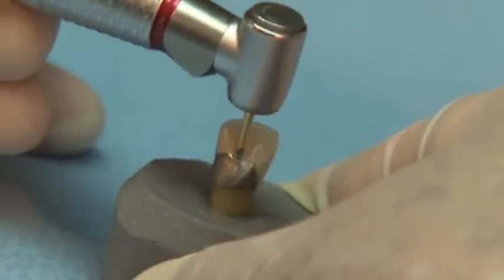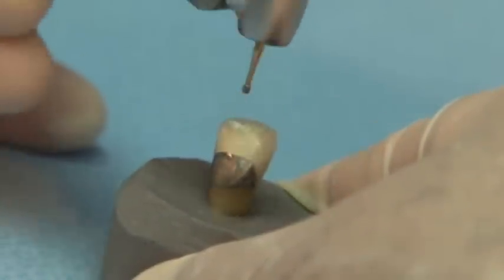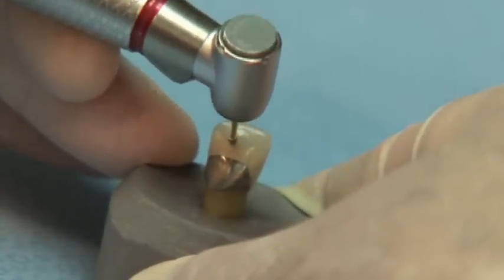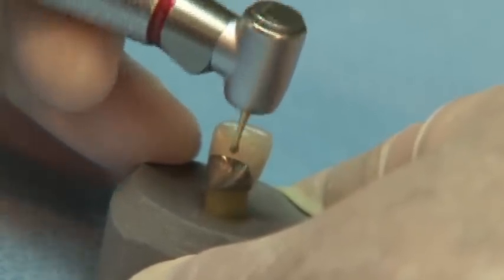It's easy to see why the Great White Burr is the number one burr in the world for cutting metal. Great White Burs will cut all of today's dental materials with precision and efficiency.